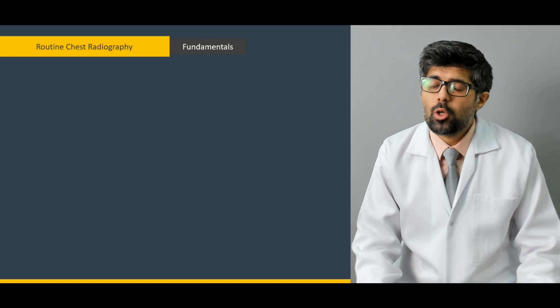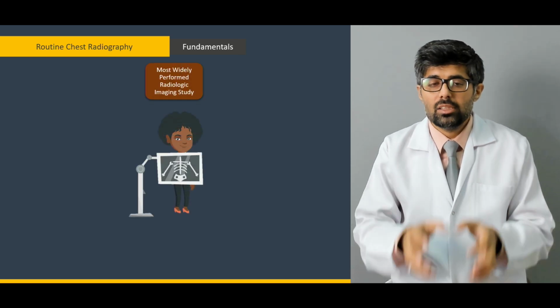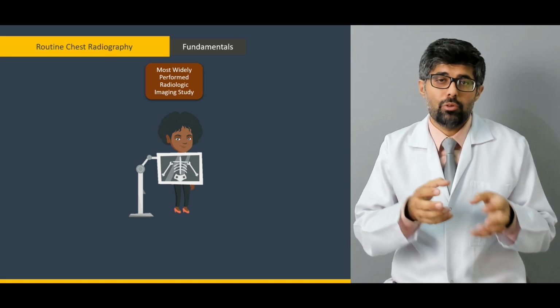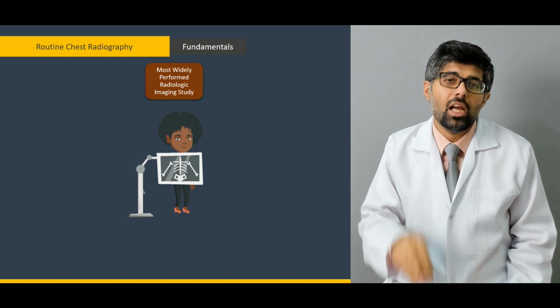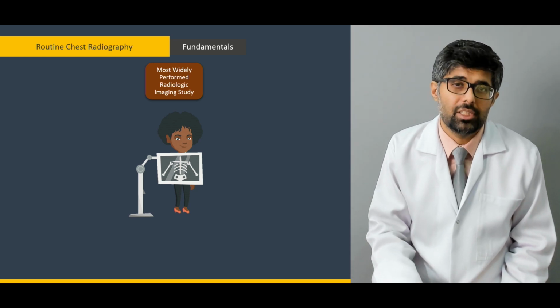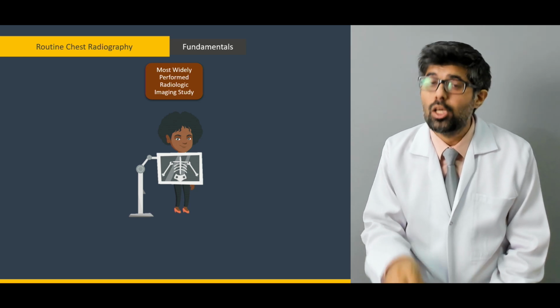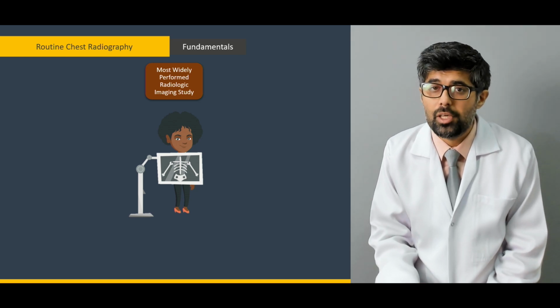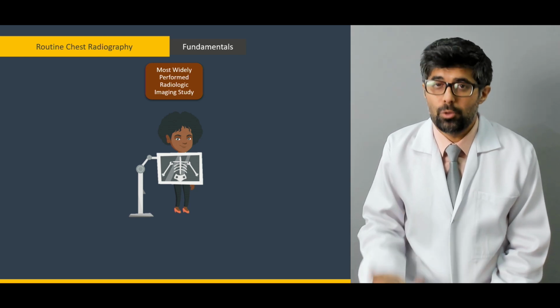Okay, we'll start off with the fundamentals. First one is that chest radiology is the single most performed radiographic study in the whole world. Now, this single-handedly tells you how important it is and how widely distributed it is. So every doctor needs to have a good grasp of it, a good understanding of it, and better judgment for it. So not only for their patients but also for their careers.